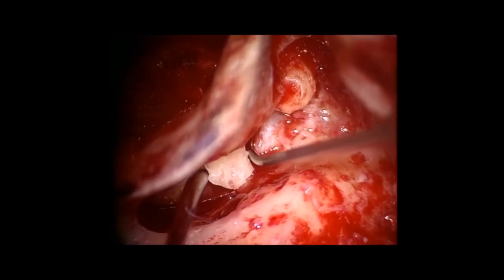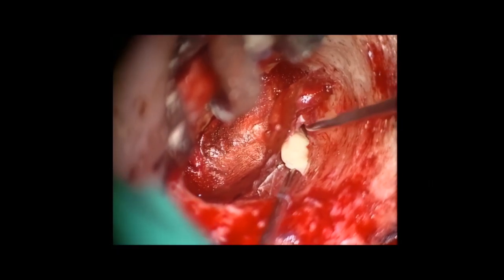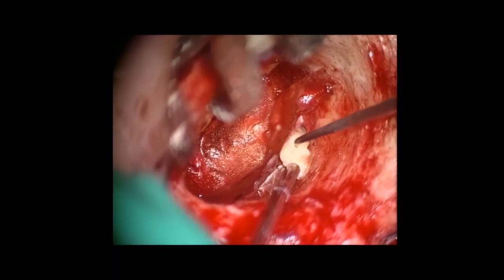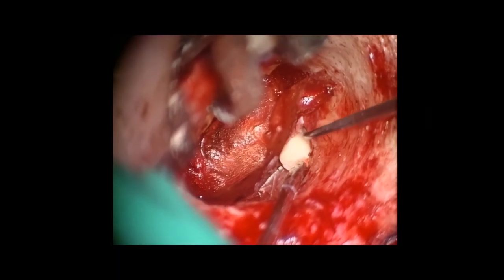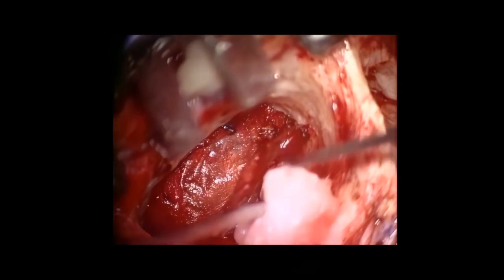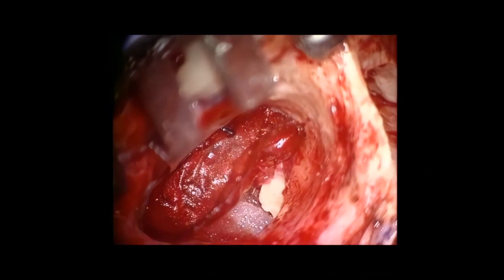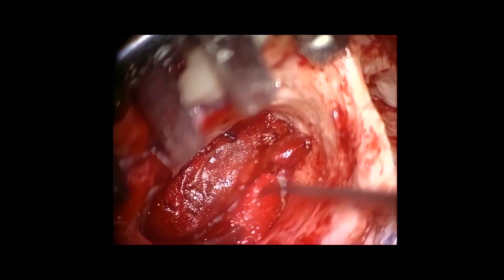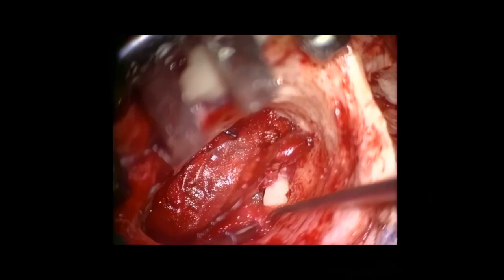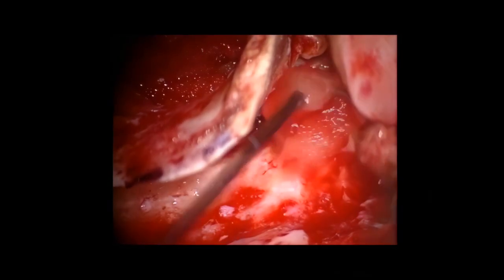Now we are looking through the posterior tympanotomy. Now I have completed the initial stages of the eardrum reconstruction and then placed the incus underneath the malleus, which already has a fascia graft in position. I surround the incus with absorbable gelatin material to prevent it from falling or moving out of position. Once I have it nicely secured, then I will complete the eardrum reconstruction or tympanoplasty.